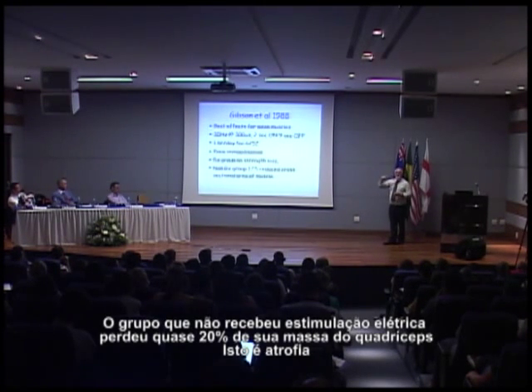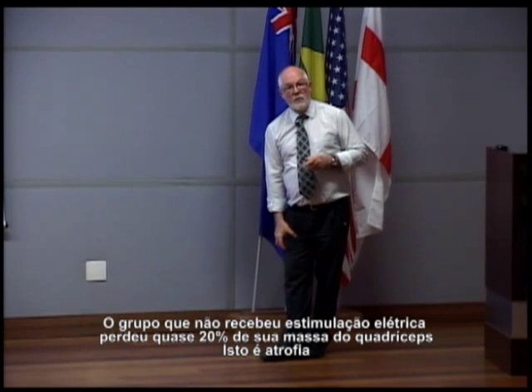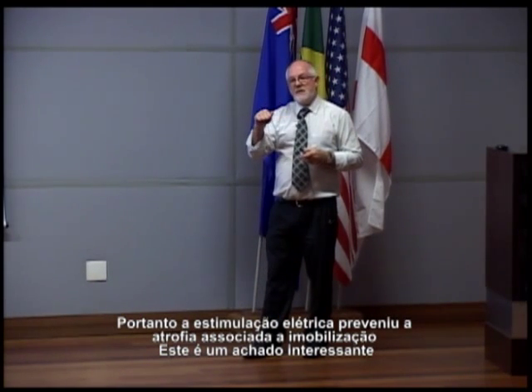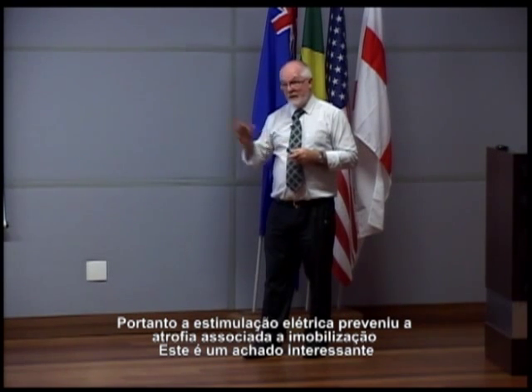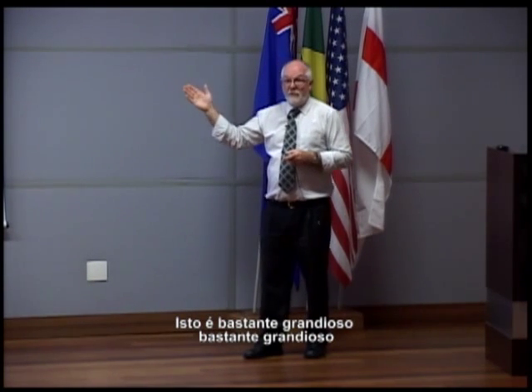The group who did not have electrical stimulation lost nearly 20% of their quadriceps bulk. That's the atrophy loss. All right? So the electrical stimulation prevented the atrophy associated with immobilization. That's an interesting finding, and that's quite powerful, quite powerful.